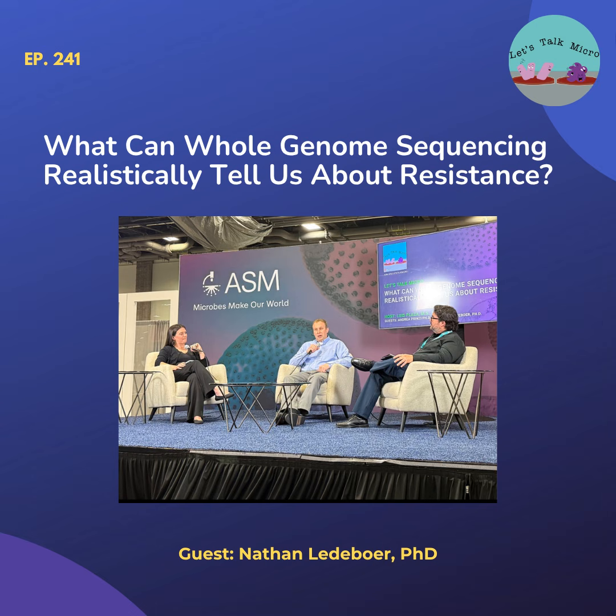If we're coming out of a patient specimen where 99% of the specimen that we're sequencing is human, we first have to find a way to dehuman that, and then to enrich for the microbial signature, to then be able to get to an ID, and then probably sequence even a little bit deeper to get to resistance information. Again, presence or absence of a beta-lactamase, presence of a point mutation, and then we'll have to think a little bit further of how much farther do we want to go, and what other sequencing tools do we want to employ in terms of what information we are trying to get out of that specimen.